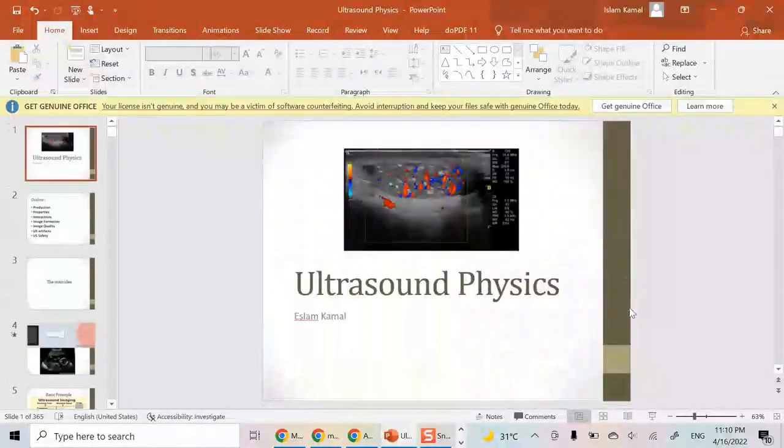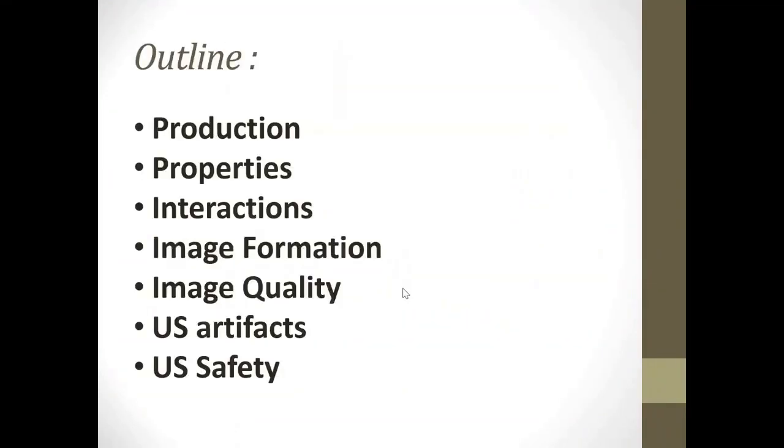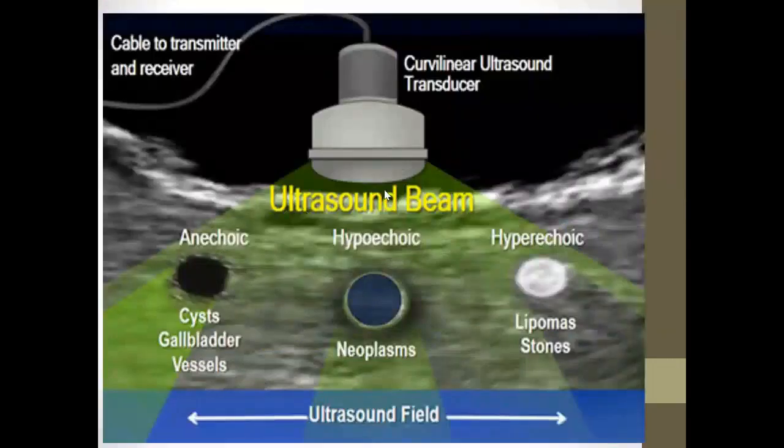Last time we started with ultrasound and talked about ultrasound physics, covering the main idea regarding ultrasound imaging and the concept of ultrasound transmission. We discussed how you receive the ultrasound pulse after it interacts with the various elements inside the patient's body, and how this is then translated into a signal that can be hyperechoic, hypoechoic, or anechoic.